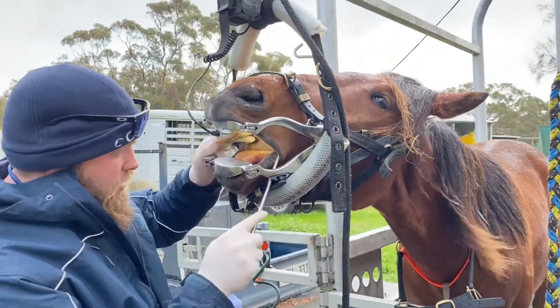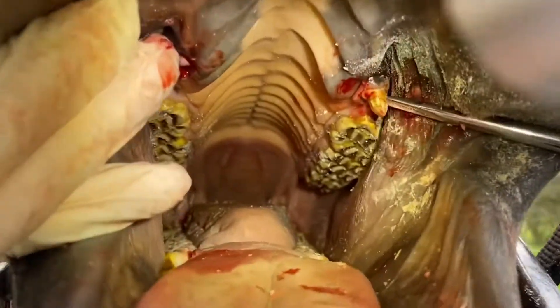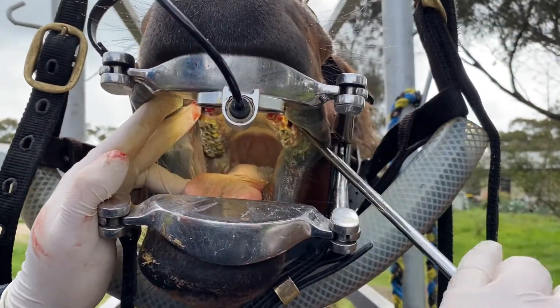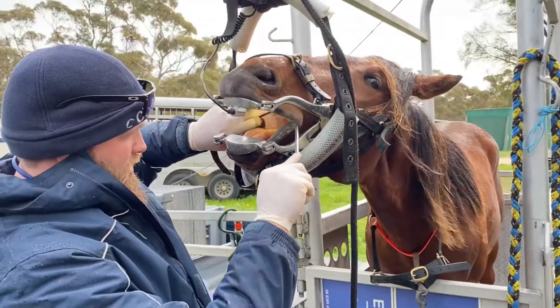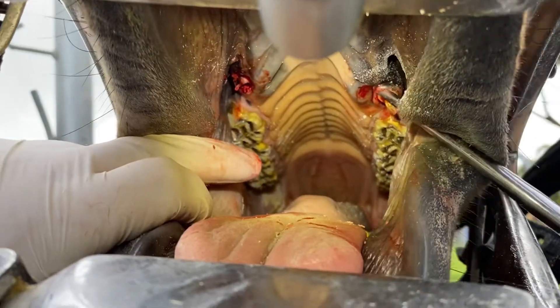We've already taken one out and we are now working on our second wolf tooth here, which obviously, as you can see, wolf teeth sit right where your bit is going to sit. So when you put a bit across this horse's mouth, you could potentially have a lot of problems. We're going to get this out. This one is sitting cranial to where most wolf teeth normally sit — they usually sit just in front of the first premolar. These ones are sitting cranial.